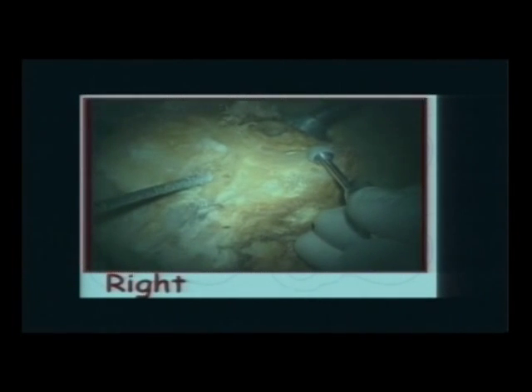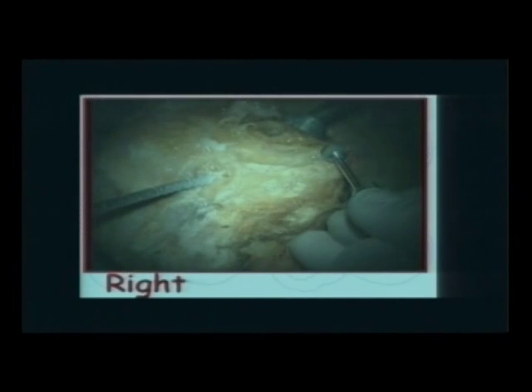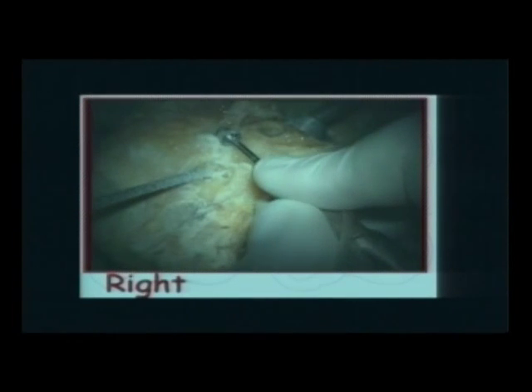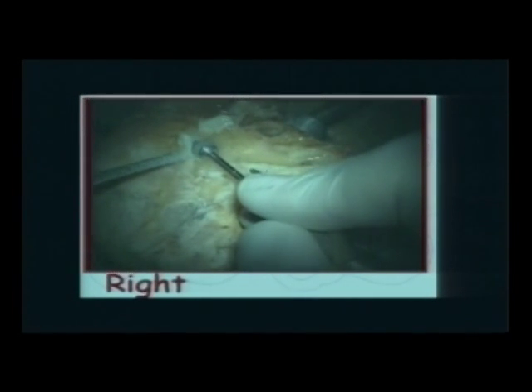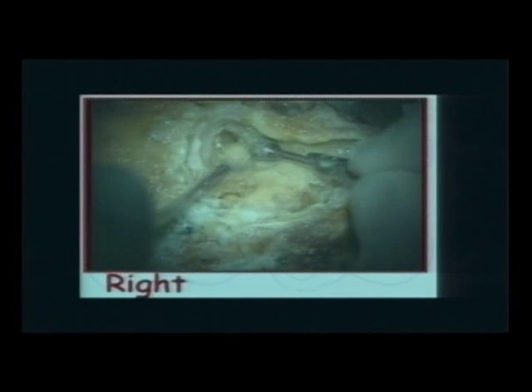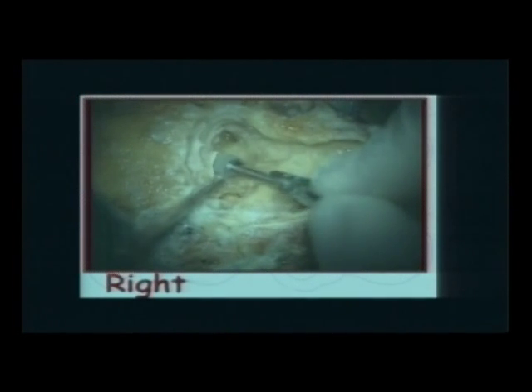We're doing a mastoidectomy right now, okay? So we've seen everything in the map, in Google Maps. Now we are using our drills. We are destroying the bone to see the structures. Now, the first line we are going to make, and this is a right ear, is along the temporal line, and the second line is on the back of the posterior wall of the external auditory canal.